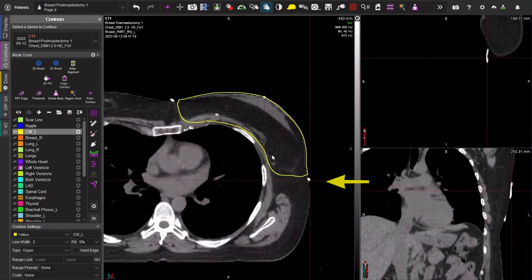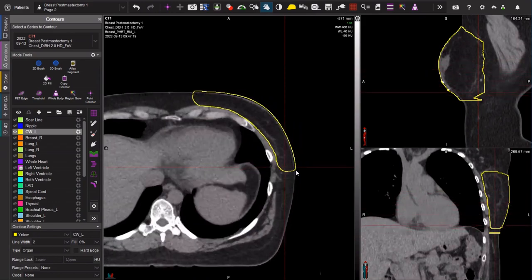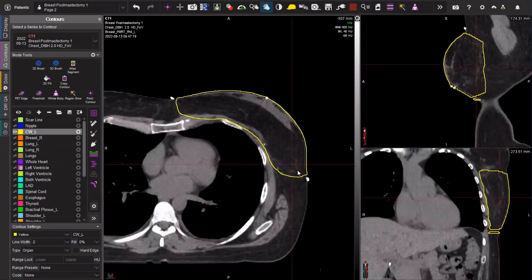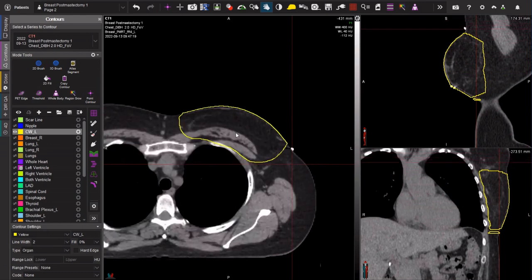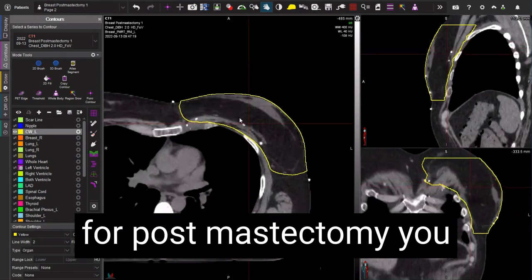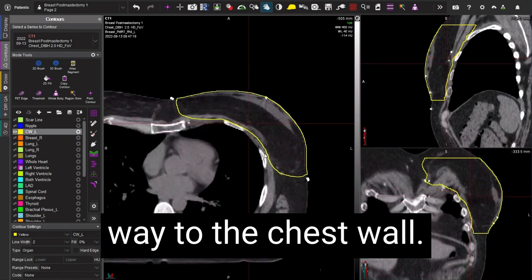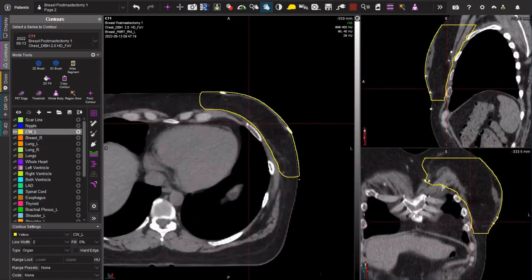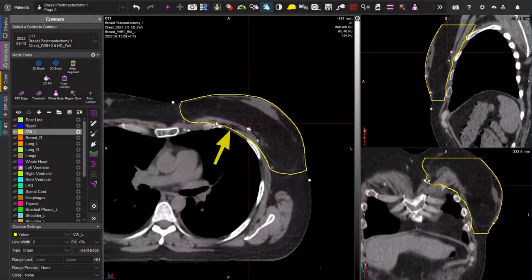Medially — and this can be a bit of a debate — in this style we go to the edge of the sternum and we don't feel there's a great benefit to extend more medially. That might be different if the primary tumor was located more medially. Laterally, we put a wire to mark the mid-axilla, but ultimately when we're contouring we're looking at where the flap is placed and where the breast was and where the area is most at risk. The posterior aspect — probably the most important — is that for post-mastectomy you want to take your chest wall contour back all the way to the chest wall, safely covering the area behind the pectoralis muscles.